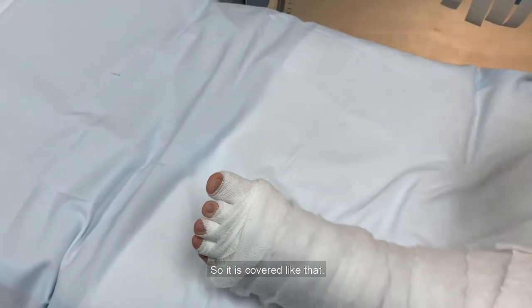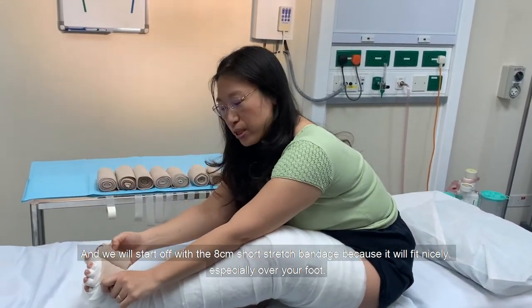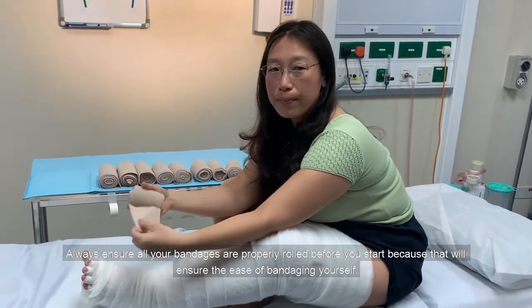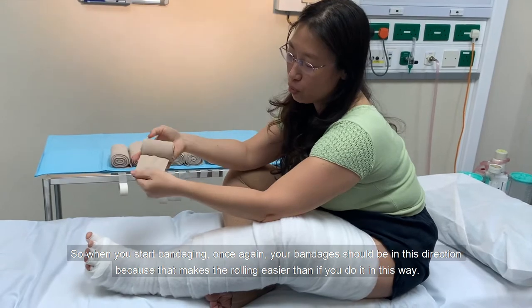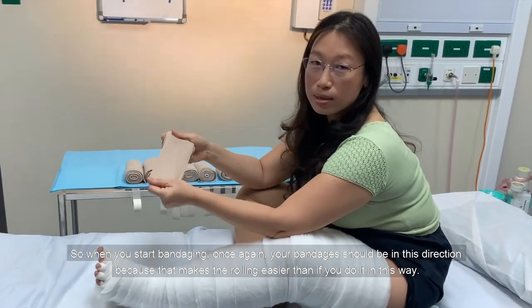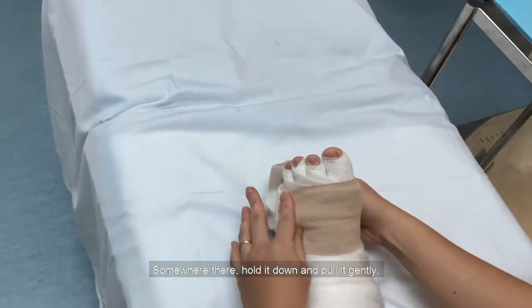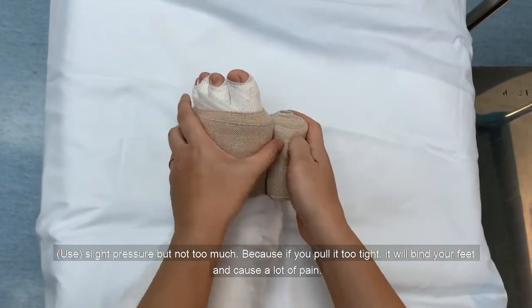We'll start with the 8cm short stretch bandage because it fits nicely, especially for the narrower parts. Always ensure that all your bandages are properly rolled before you start, because that ensures ease of bandaging. Your bandages should be oriented with the roll facing you, coming out toward you, because that makes rolling easier. Start off right in about the middle of the top of your foot, hold it down and pull it gently with slight pressure — but not too much, because if you pull it too tight, it will bind your feet and cause a lot of pain.